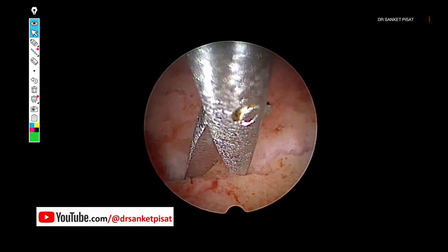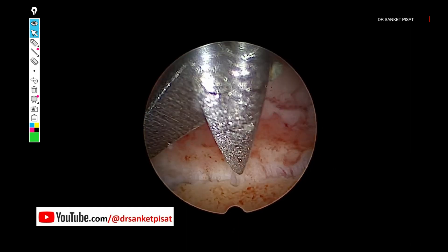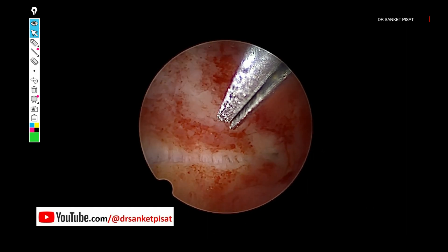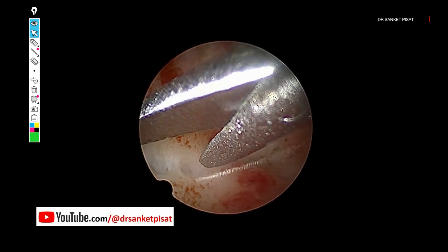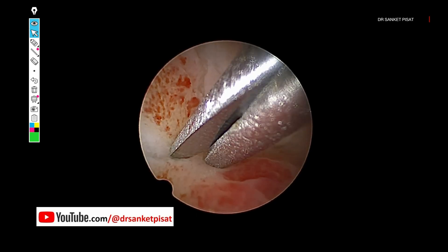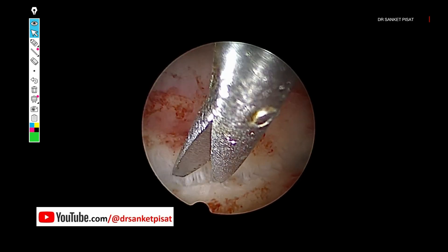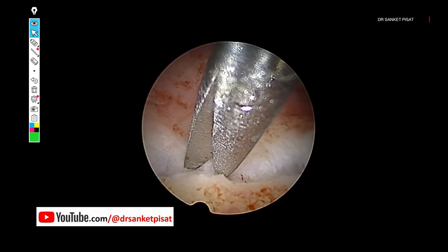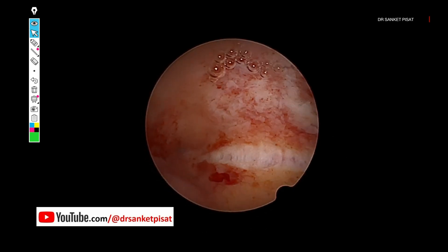We are using the simple hysteroscopic scissor — the scissor is pushed into the tissue just a little bit and the snip is made. Using hysteroscopic scissors gives very good control, allowing cuts millimeter by millimeter, as opposed to the sharp burst of energy with electricity. Both have their place, but for small septa the scissor is easier and faster with no collateral damage. Even if there is a perforation, it is not electrical, so only the uterus sustains minimal damage repairable by a suture. With electrical damage, one would have to inspect the bowel as the spread of current is unknown.